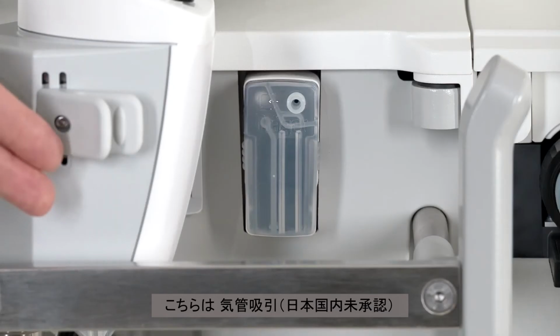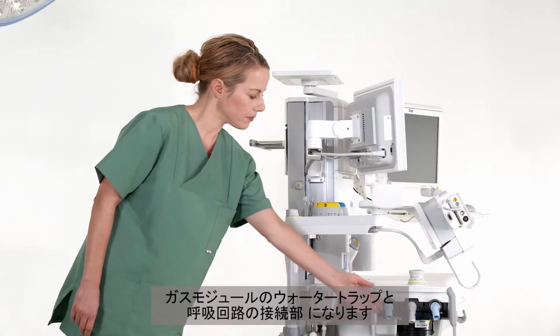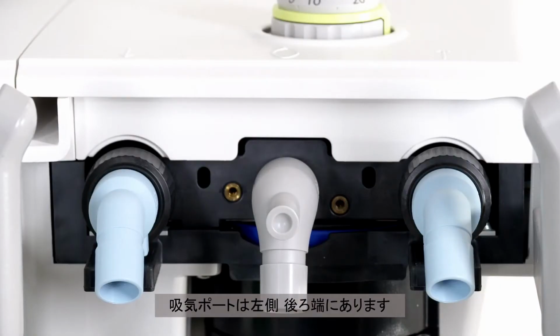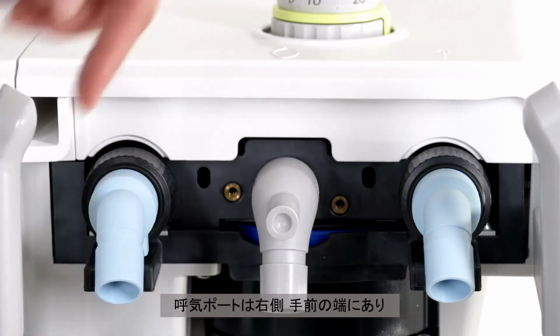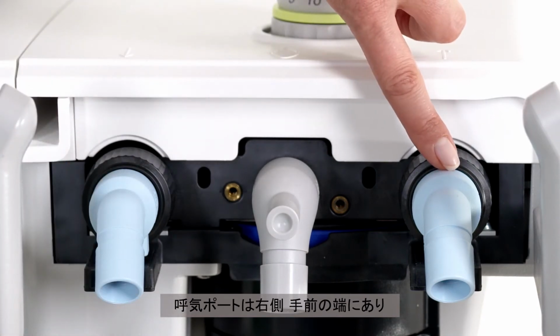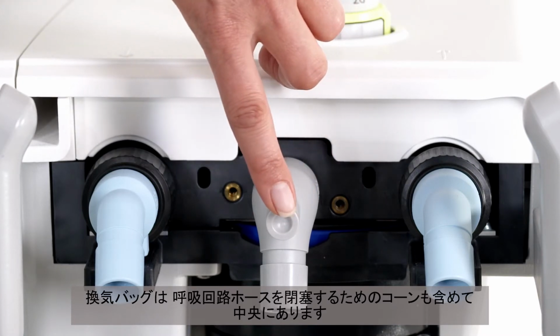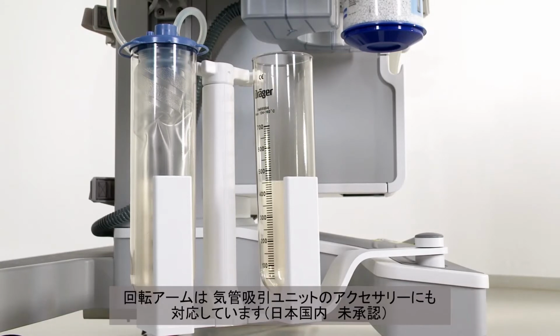This image shows the endotracheal suction, the water trap for the gas analyzer, and the connections for the breathing circuit. The inspiratory port is located at the rear end left, the expiratory port at the front end right, while a breathing bag including a cone for sealing the breathing hoses can be mounted in the centre. A swivel arm can accommodate the accessories for the endotracheal suction unit.